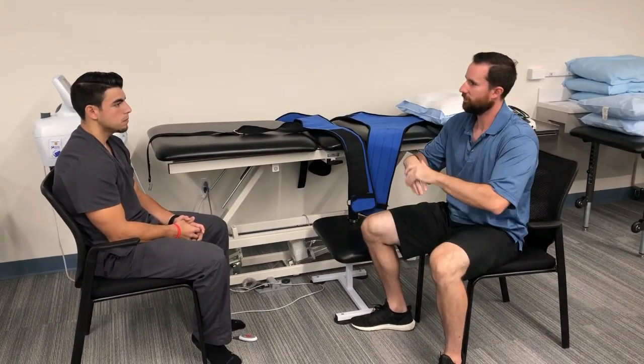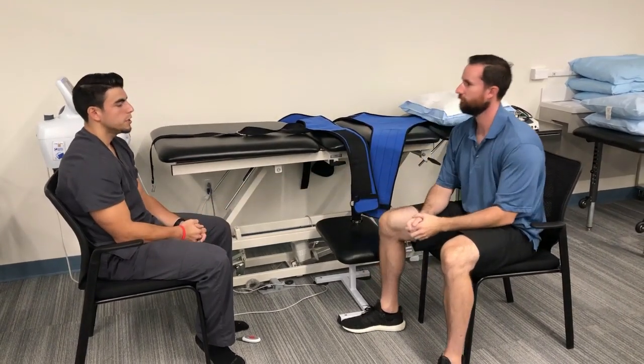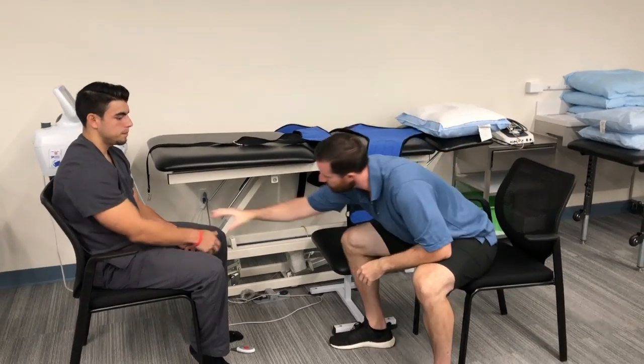Doing good. My name is Zach Splinter. I'm a student physical therapist at the University of St. Augustine. And your name is? Jacob. And your birthday? May 23rd, 1995. Okay, and let me double check that on your wristband.